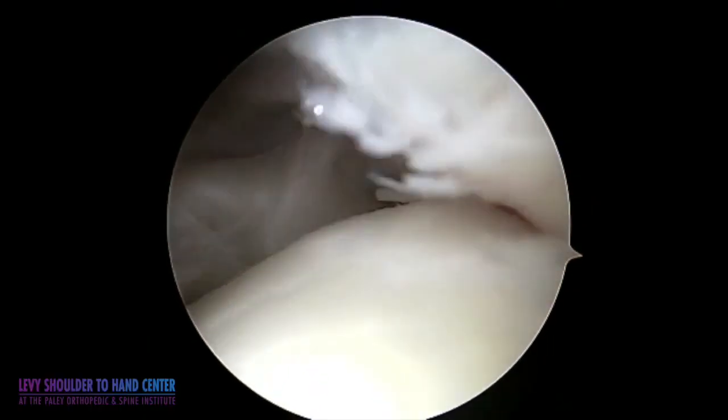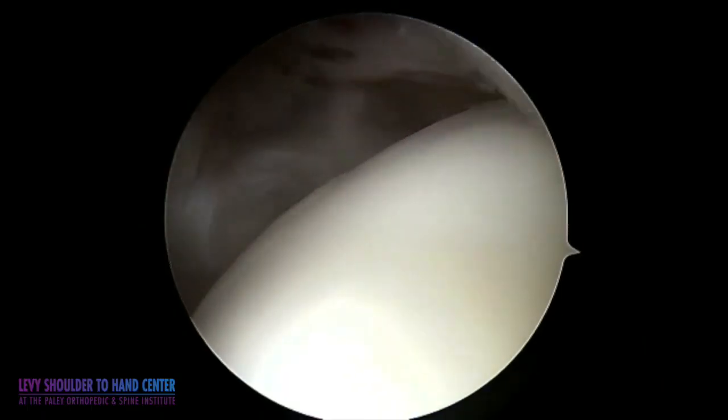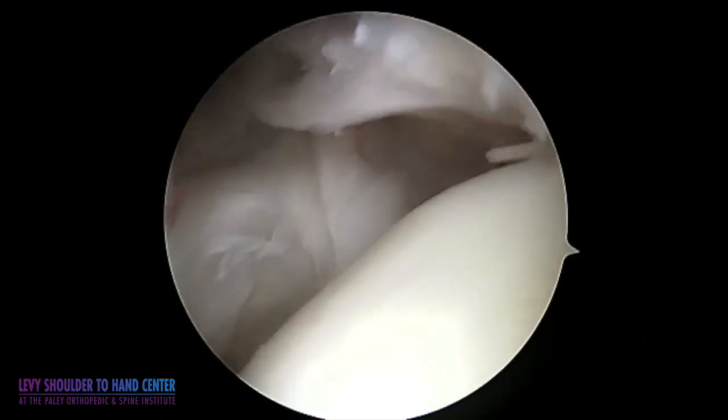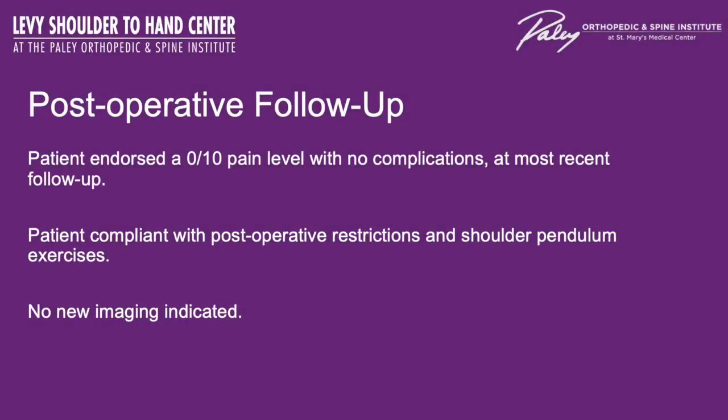This is an intra-articular view where you can see an edge of the graft as well as reconstitution of the bone tendon interface. Her post-operative course was excellent. She had no pain, and she was doing quite well throughout her rehabilitation course.